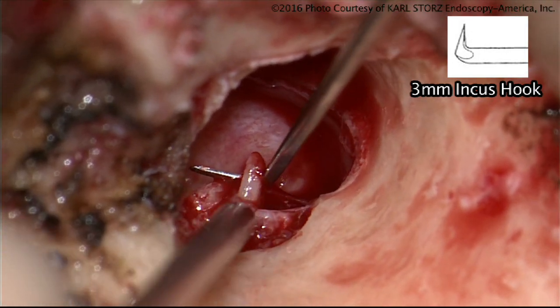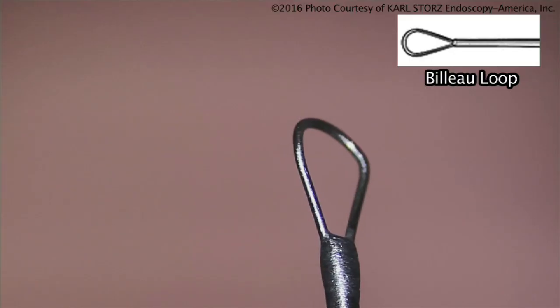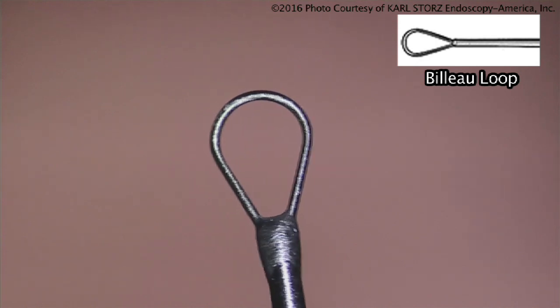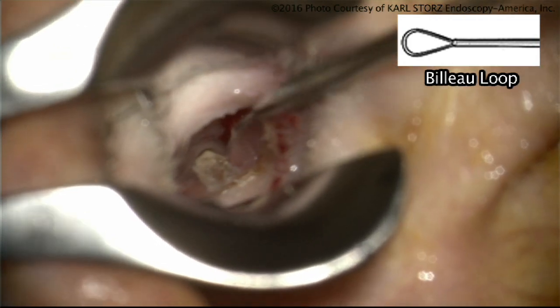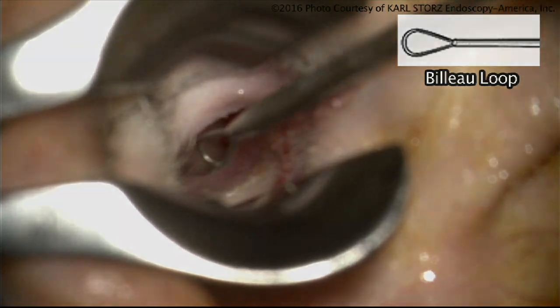We also use this hook for removing cholesteatoma in the middle ear space. This is a cerumen curette, or a Billeau loop — two functions: simply to clean the ear canal of wax, or as Jim Sheehy taught me, to place the fascia beneath the malleus handle during a tympanoplasty. When we do a tympanoplasty using a lateral graft technique, you always want to stabilize the fascia beneath the malleus handle.